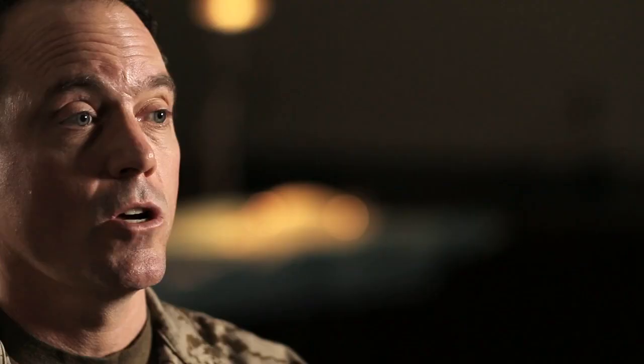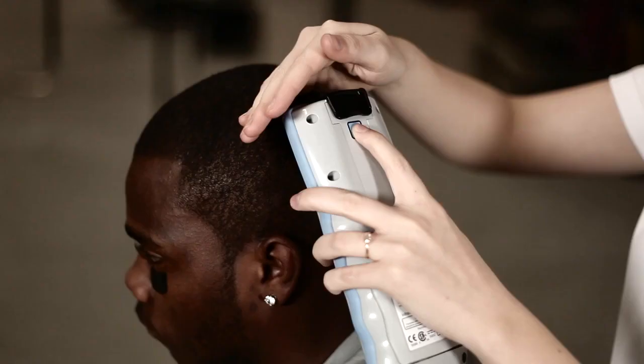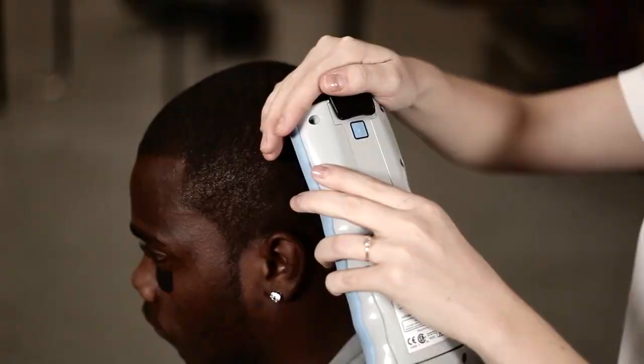When you press the button you immediately release it and you'll hear an audible beep. If you're in a loud environment and unable to hear that audible beep, the screen will actually go blank. When it's done with the read or the scan for that region, it will flash back on.